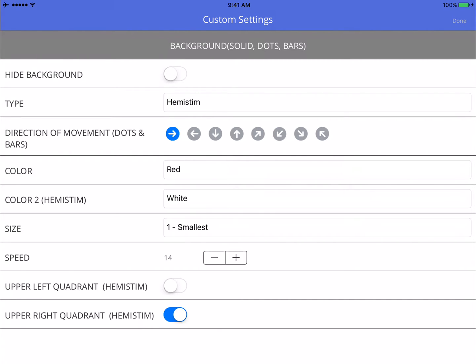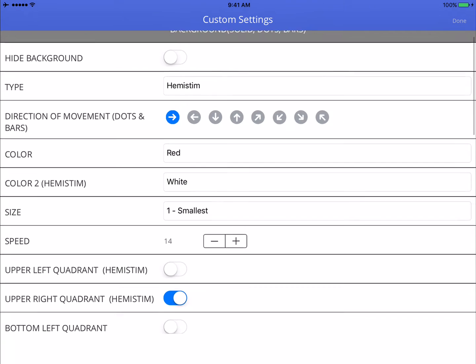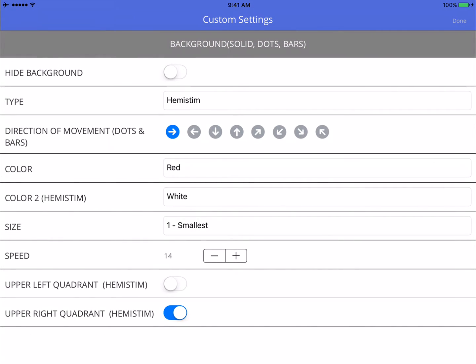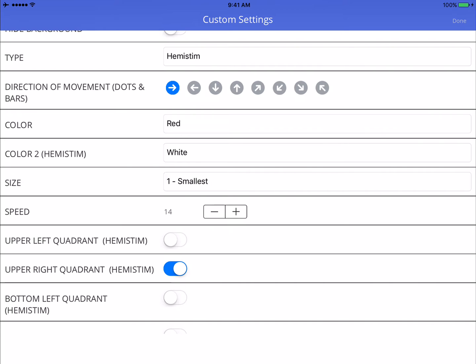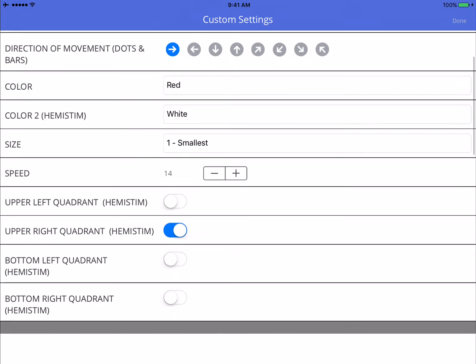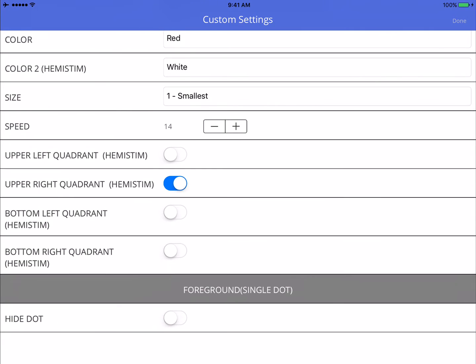And I'm actually going here for a left temporal since he's having a hard time with word retrieval. So I am actually creating a background stimulation here of a hemi-stim, and if we go down a little bit lower here, you'll see that I chose some of the smallest size for the square to be, because the left brain actually prefers detail and smaller objects. The left brain does respond well to red, so I picked the red and white colors for the hemi-stim.